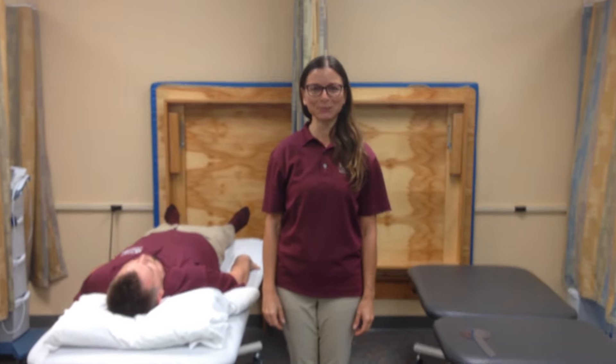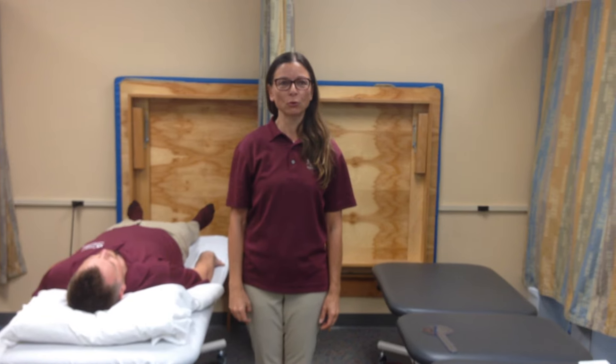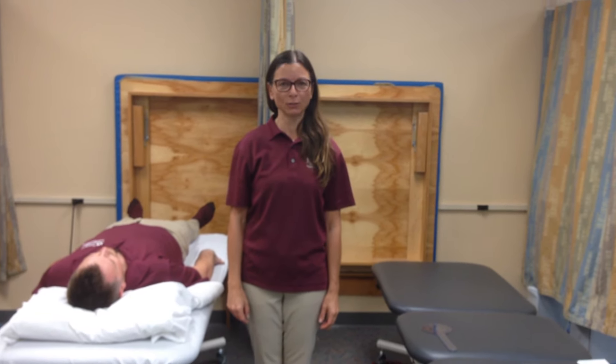Hello, my name is Svetlana Calderon and I'm a physical therapist assistant student here in Miami Dade College. Today I'm going to demonstrate measurement of range of motion for right shoulder internal rotation.